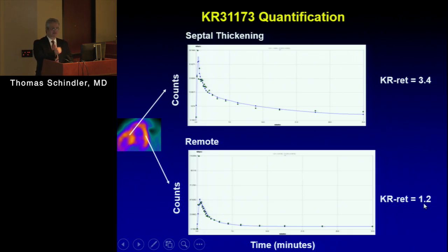And now you can imagine this patient is probably likely to benefit from ARB inhibition to avoid future development of heart failure and/or interstitial fibrosis, more than someone else who may have low AT1 receptor expression. So we can, in the future, hopefully individualize treatment therapy in these patients by receptor imaging, giving an adequate response, showing whether the patient benefits from ARB inhibition or maybe not, or whether the patient has a sufficient dose to suppress the signal so he's adequately treated.